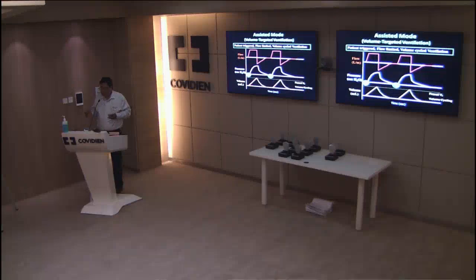Now flow is easy to say. Suppose the time given for each inspiration is 1 second, and you know the tidal volume in ml. You can calculate that so much tidal volume has to be delivered over so much time, so the flow can be calculated, because the flow is constant. The flow doesn't change; the rate of flow is the same. What will change will be the pressure. But flow is constant. So volume control ventilation is patient triggered, flow limited, and volume cycled.